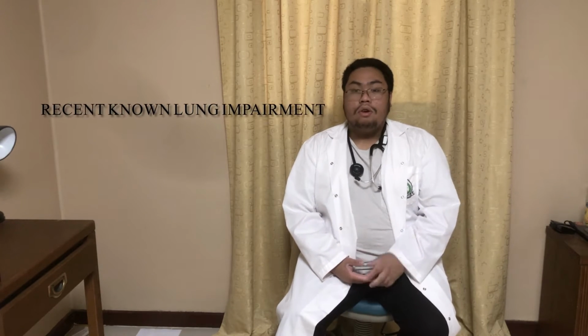And then third, ask them if they are suffering from cardiovascular illness or unstable cardiovascular status, pneumothorax, pneumonia, or hemoptysis of unknown origin. Because all of these conditions might highly affect the lungs.